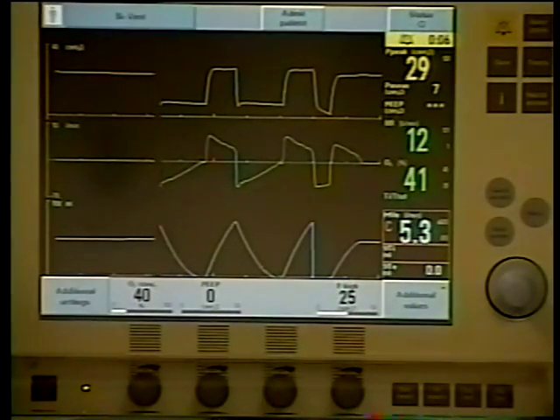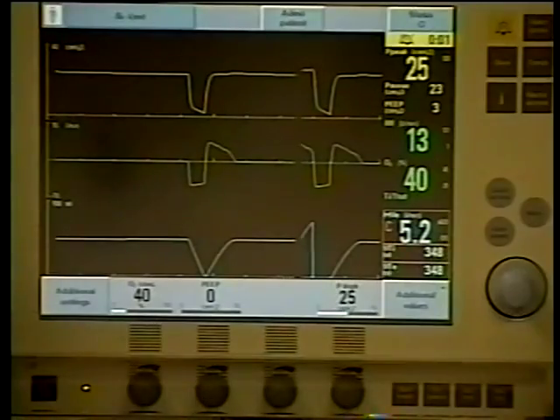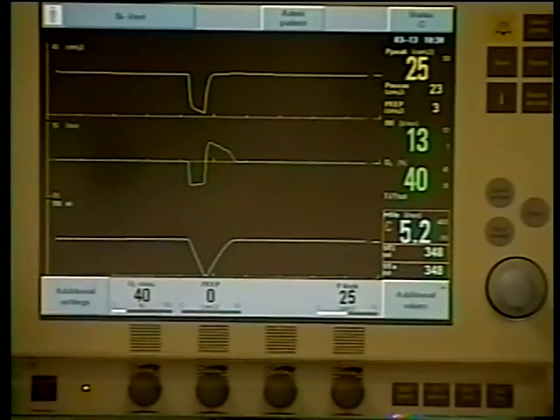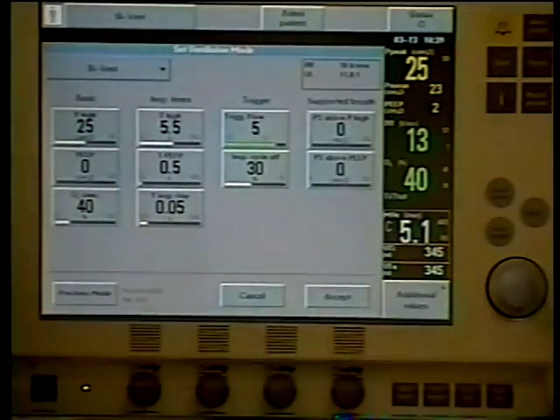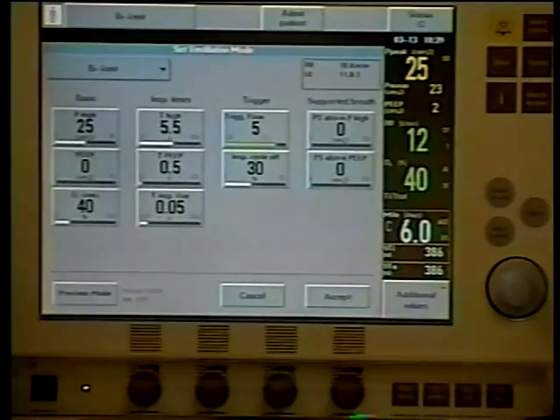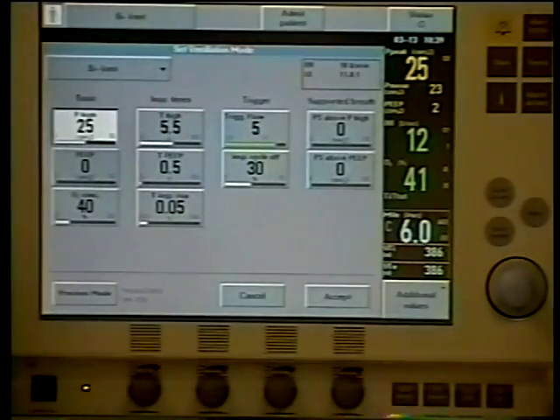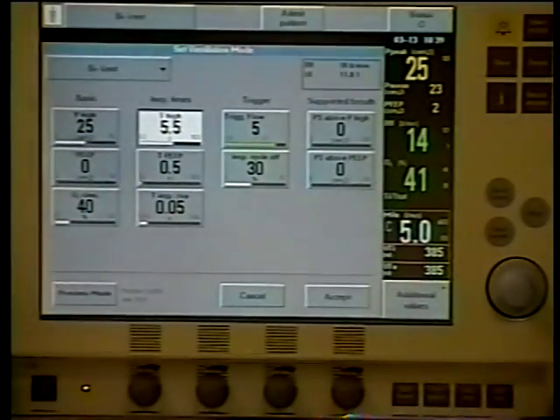So my advice to avoid that, and really the way to overcome it, is you can start a weaning process in bivent. Probably the easiest method, or the most described method that you'll hear or see about, is the drop and stretch. You'll see that in papers written. The drop refers to the P high. So I'm going to start dropping the P high, and the stretch refers to the T high. I'm going to start stretching the T high out.